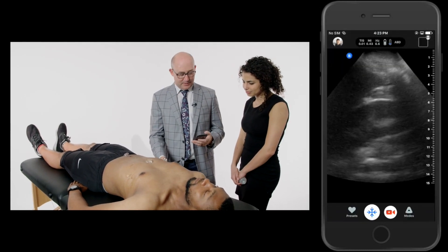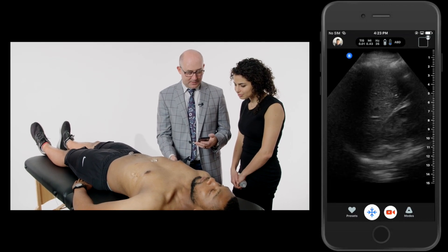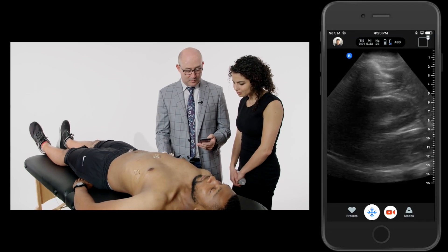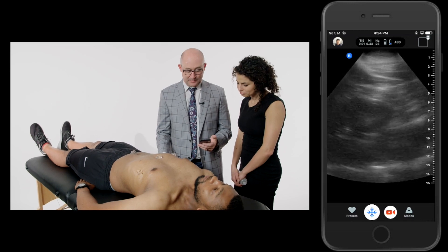I'm going to look over here at his Morrison's pouch. Here's his liver. We see his diaphragm there, kidney. As he takes a deep breath, I can see his lower pole of the kidney on the screen. You can see the psoas muscle back there behind the kidney. Looks great.